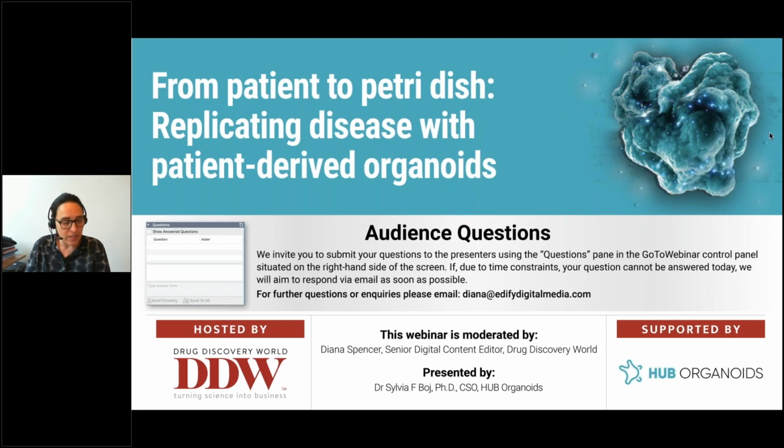Another important one, at least when seeding the isolation or the material that has been processed, is to try to seed it in the minimum volume of Matrigel possible, so not more than 2 wells of a 24 well plate. Also, try to ensure that the limited number of tumor cells available in the biopsy are together. We believe that, as part of the media that we are providing, there is an important paracrine secretion from these tumor cells. So the more concentrated we have the tumor cells from the biopsies in a well, the more it increases the efficiency to establish an organoid culture out of this biopsy.